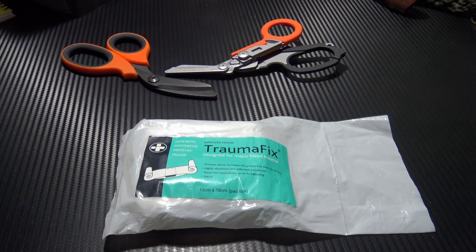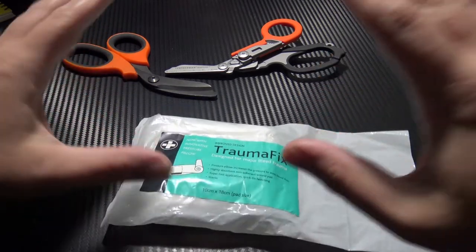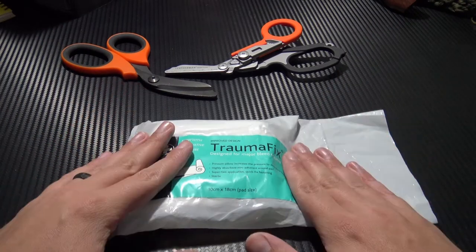Hi everybody and welcome to Survival Dads. Today we're going to take a look at this — a Trauma Fix wound dressing. This is designed for moderate to severe bleeding.